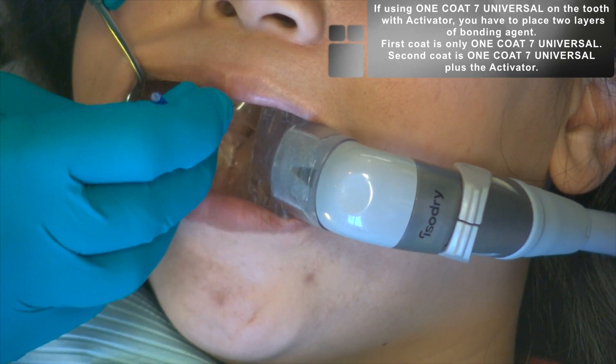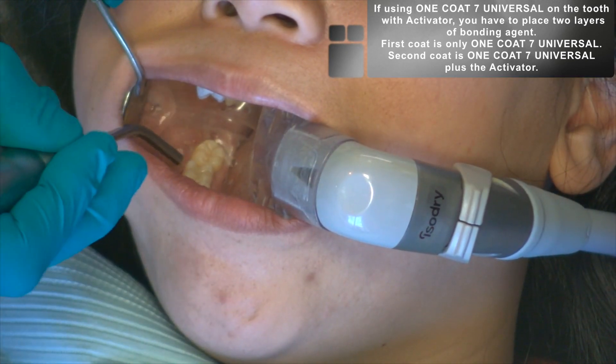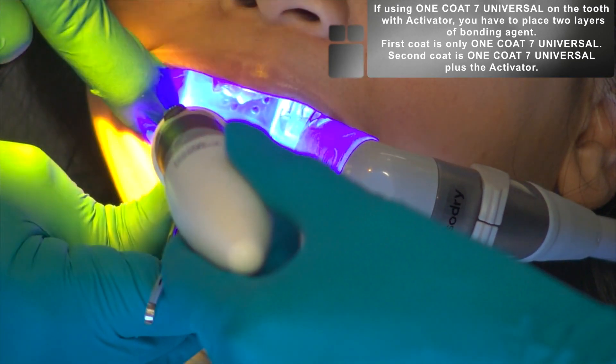Apply the bonding agent to the tooth structure with a micro brush and blow the excess solvent from the bonding agent. Ensure that the bonding agent is thin and light cure the bonding agent to the surface of the restoration.